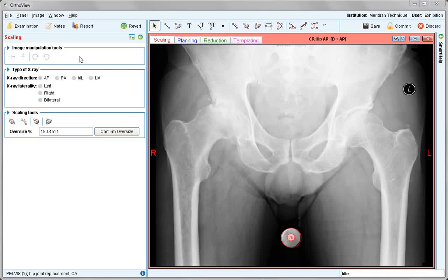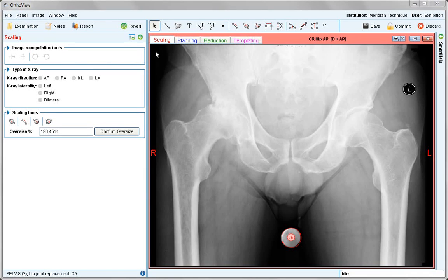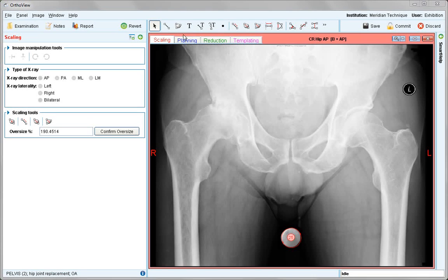In this pre-prepared OrthoView session, we see the various stages available to us in most typical procedures. To begin with, Scaling, where a calibration device is used to calculate the magnification of the image.